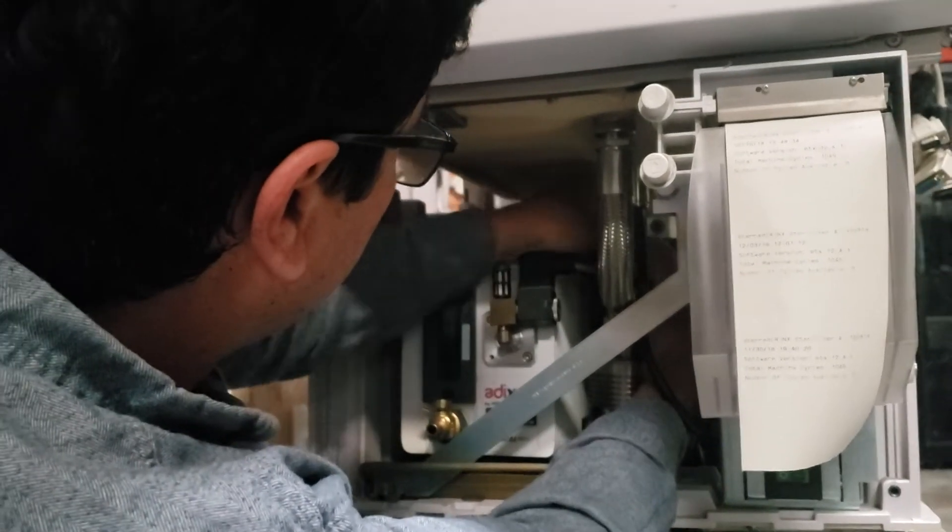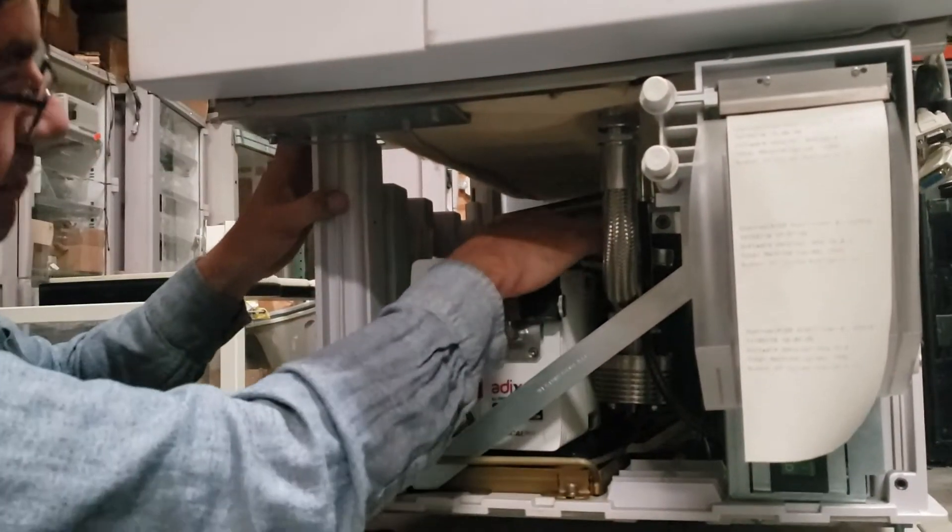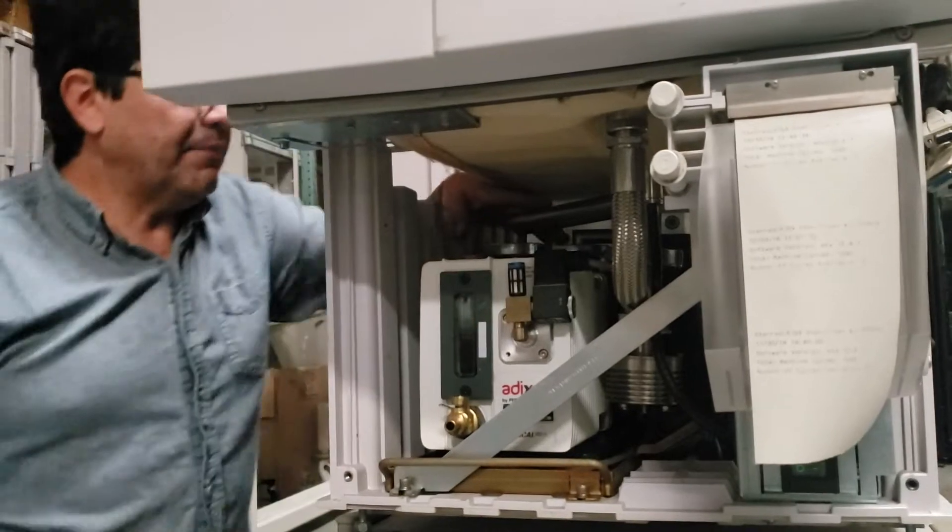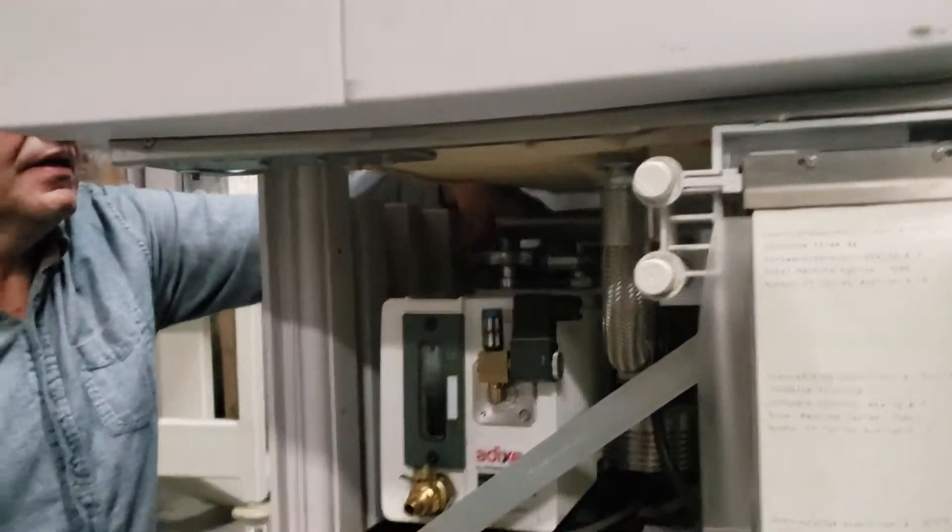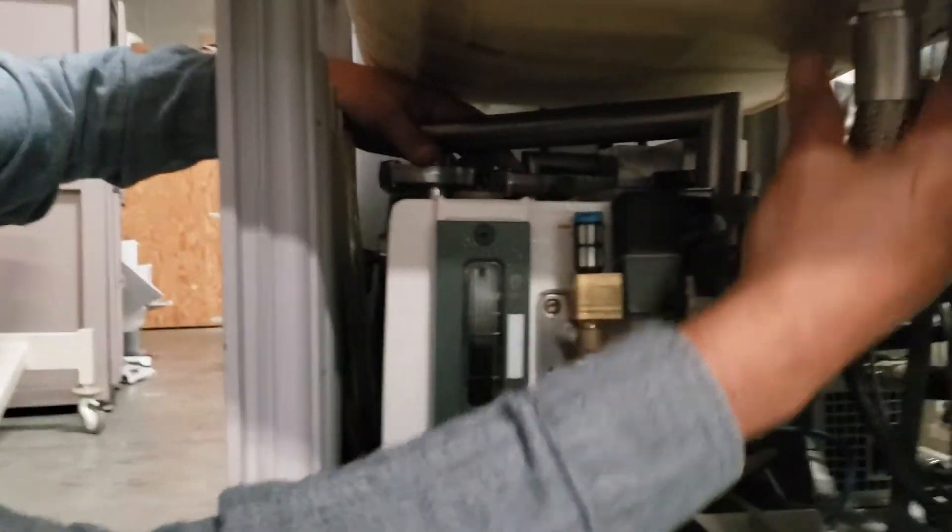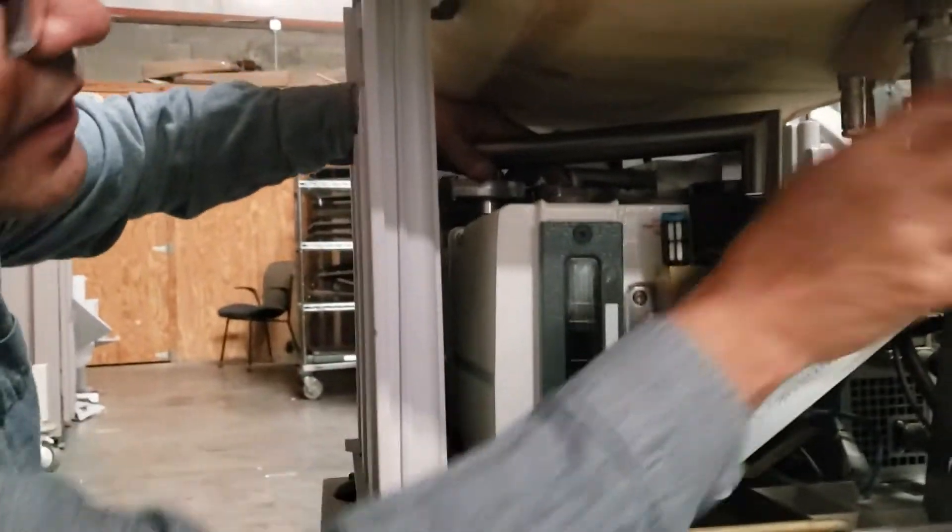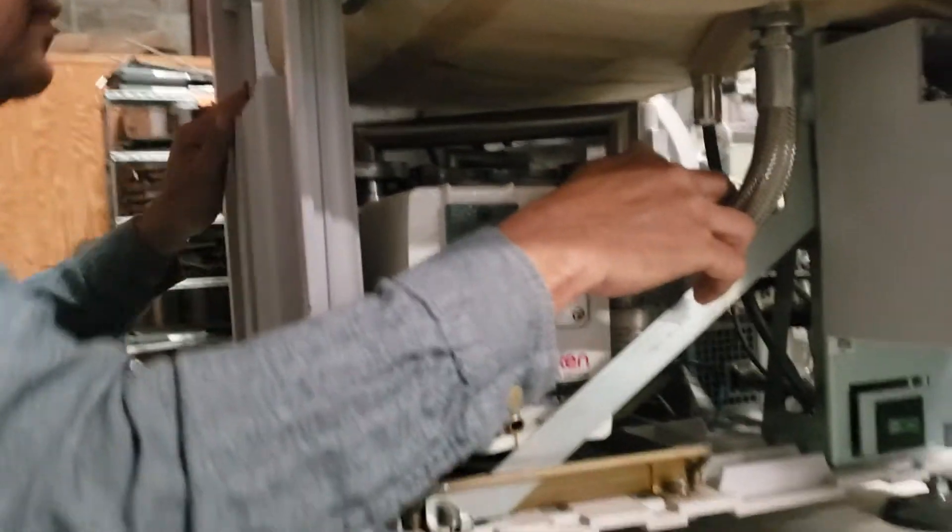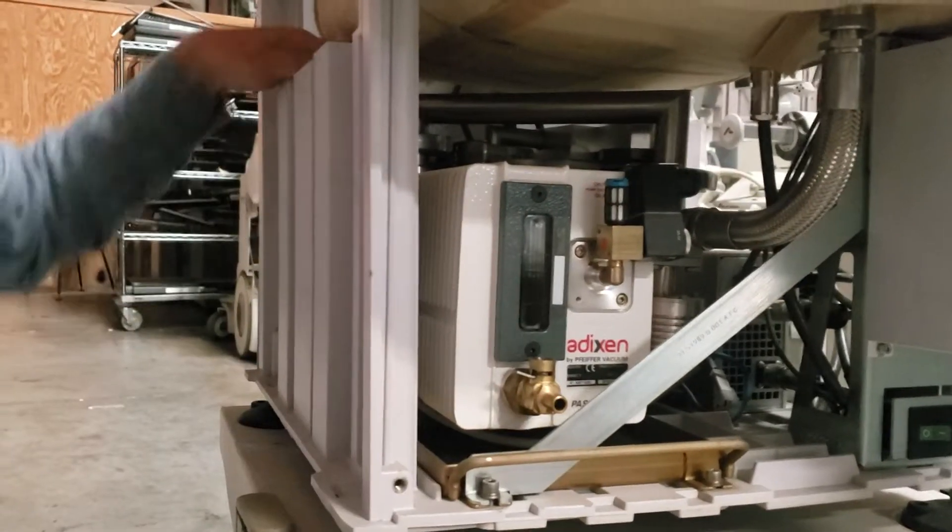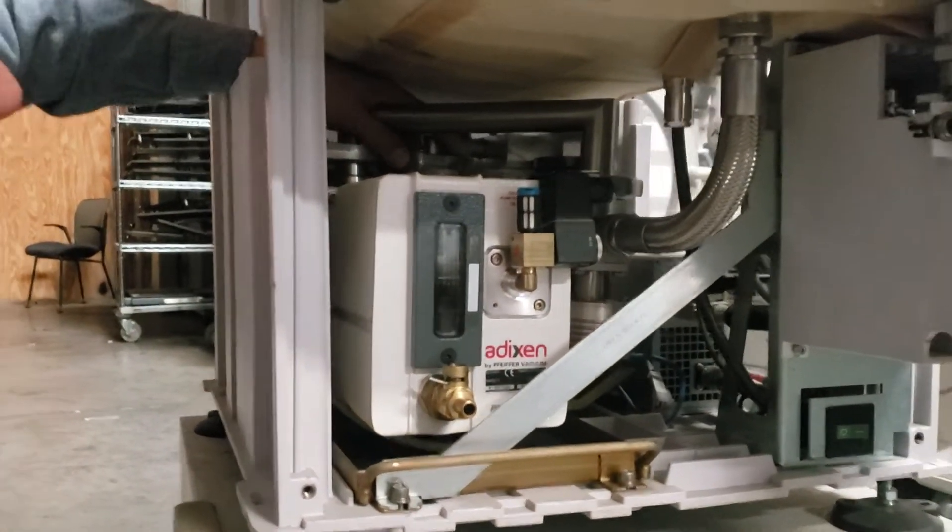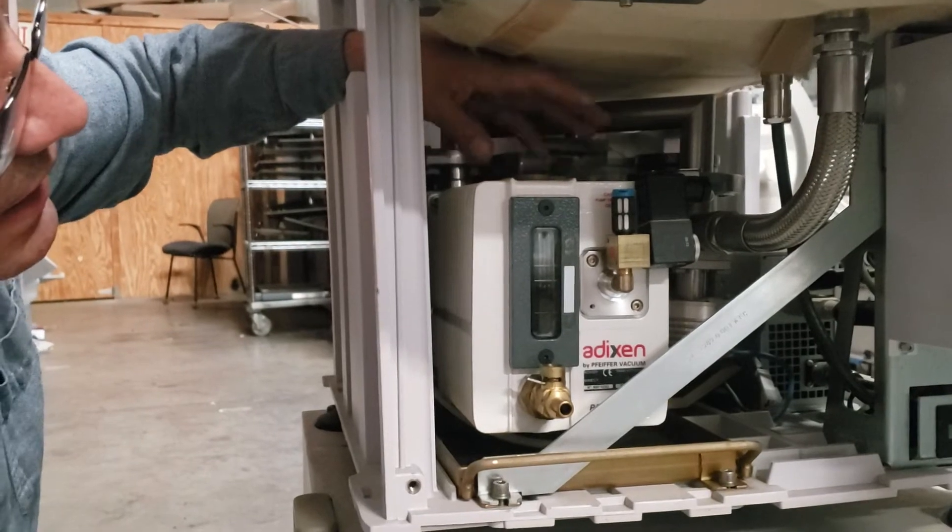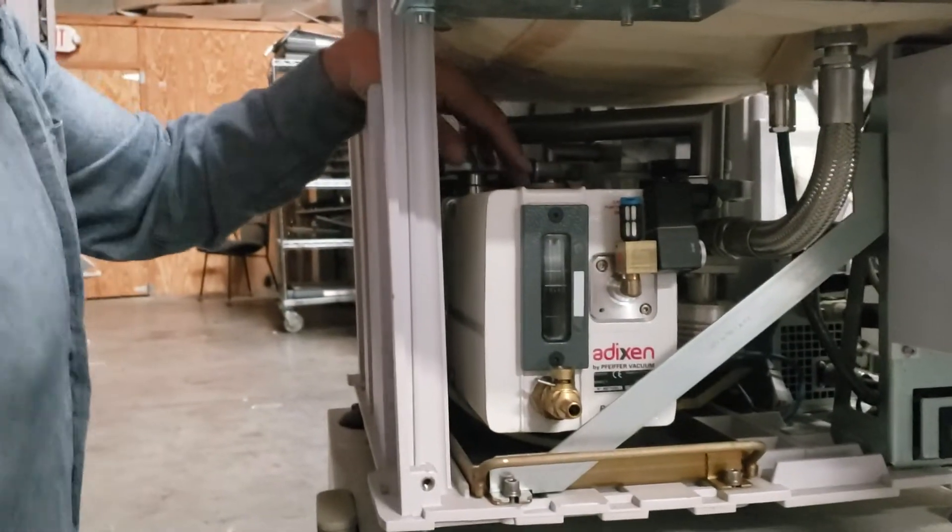So this clamp, those two clamps here, top of the vacuum, this metallic hose under the chamber, those are going to be the critical points that you need to check for the leak.